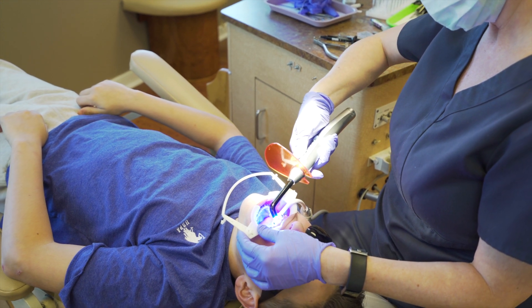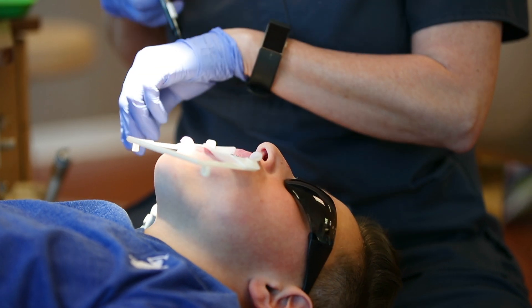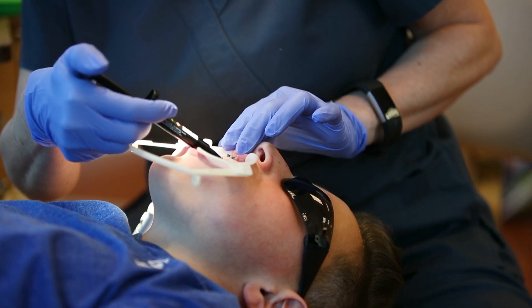This is a blue light that helps the adhesive stick to the tooth surface. This is the actual adhesive we build the bite blocks out of.